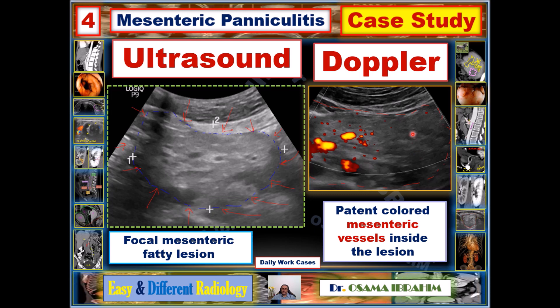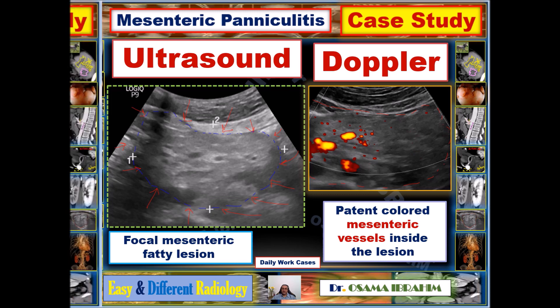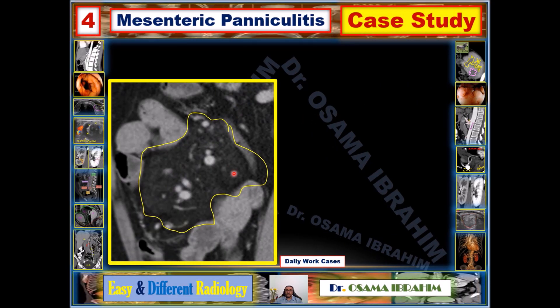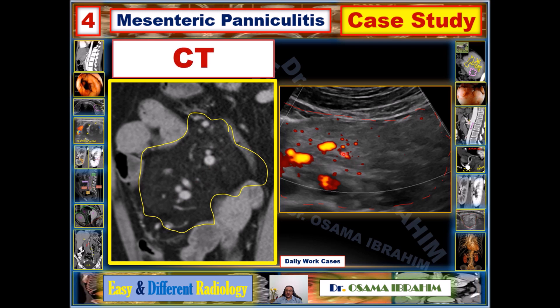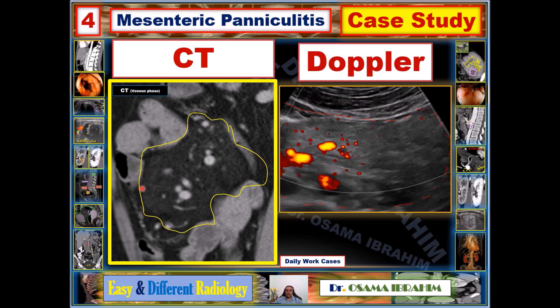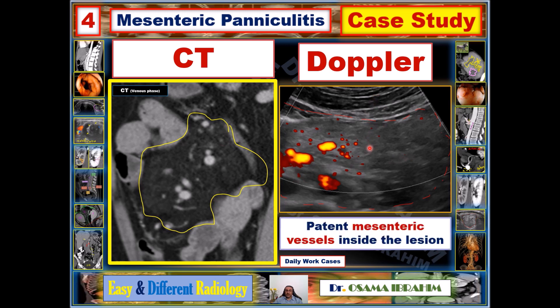These patent vessels represent mesenteric veins. CT was performed to exclude a mesenteric mass, and I found mesenteric fatty lesions with vessels inside, consistent with the Doppler study performed as the initial examination. A fatty lesion in the mesentery with patent vessels inside is representative and diagnostic for mesenteric paniculitis.